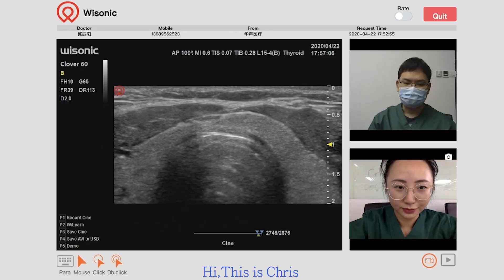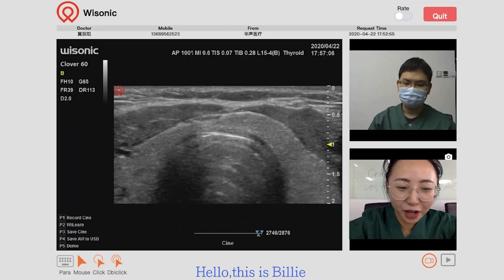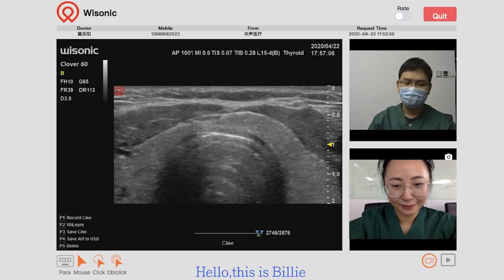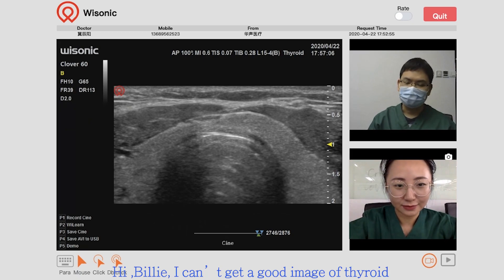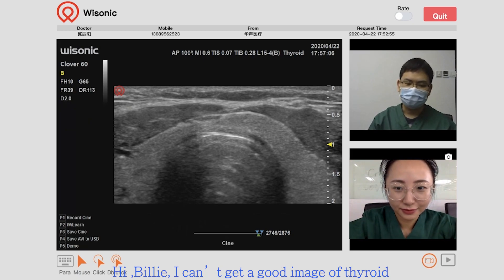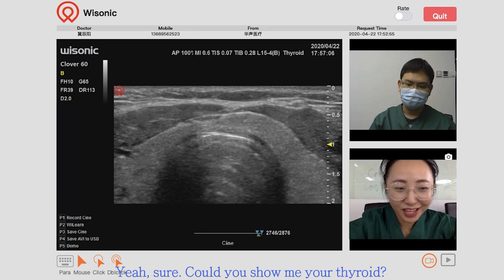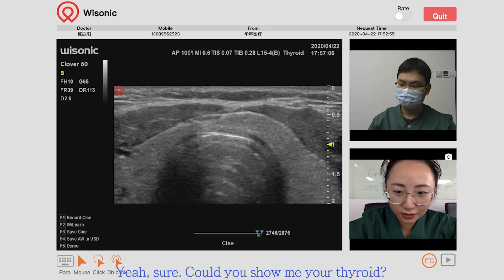Hi, this is Grace. Hello, this is Billy. Hi Billy, I can't get a good image of the thyroid. Could you give me some advice? Sure. Could you show me your thyroid?